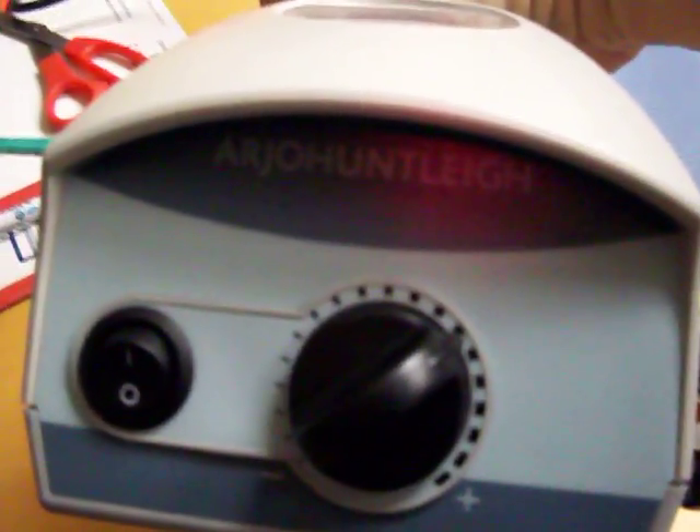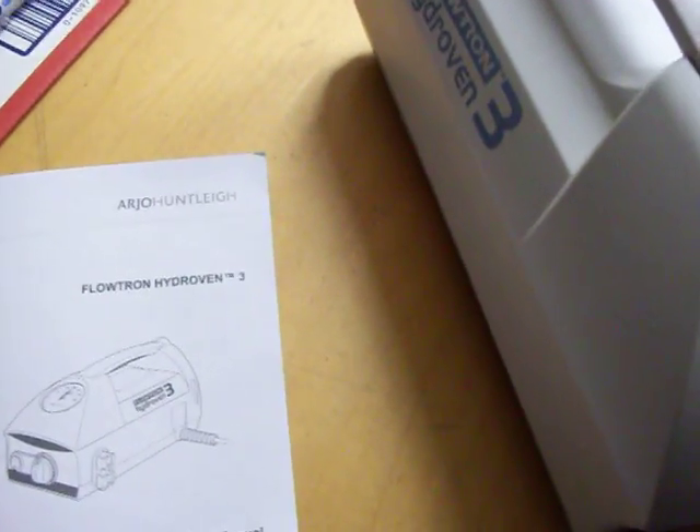Always consult the book — which I'm going to show you right here — always consult your Flowtron Hydroven 3 manual.